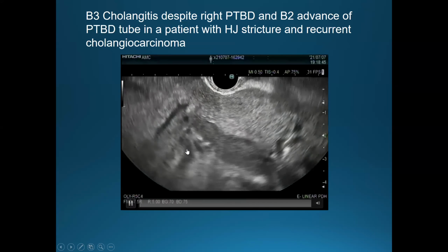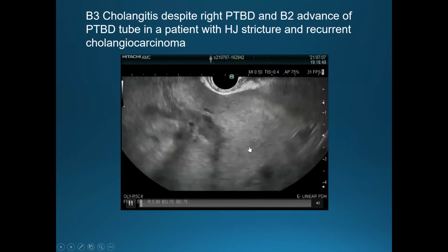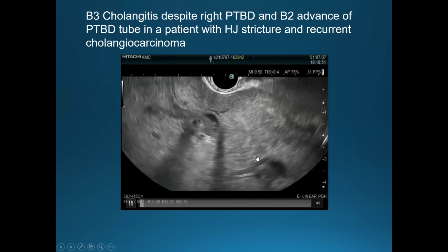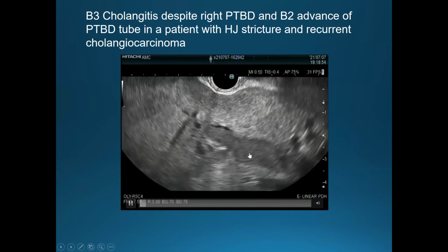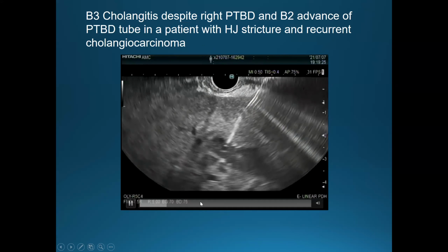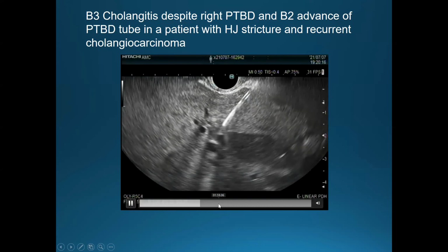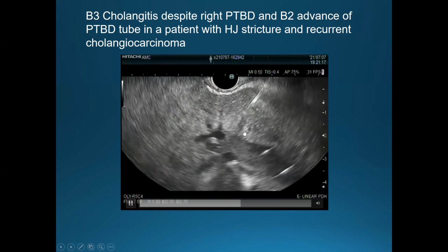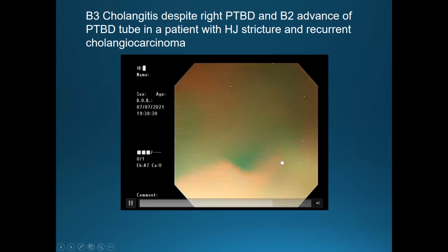So let me show some EUS findings. This patient has a very marked dilatation of the bile duct, and there is a large amount of sludge or some debris inside the B3 duct. After puncture with the needle, the guide wire goes through the hilum, and here we have used the one-step device, partially covered with distal flaps.